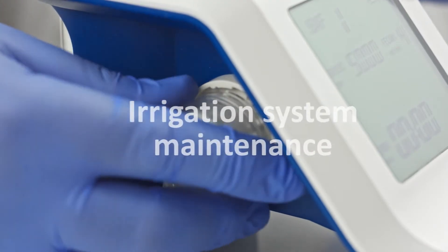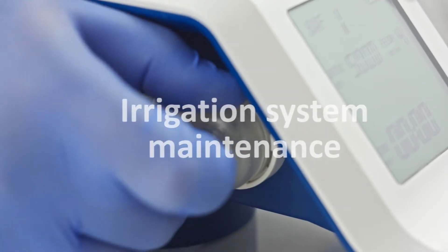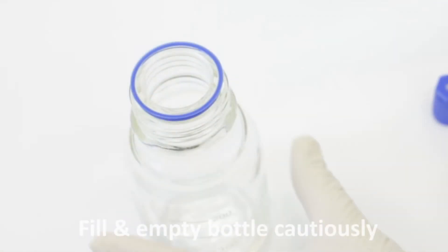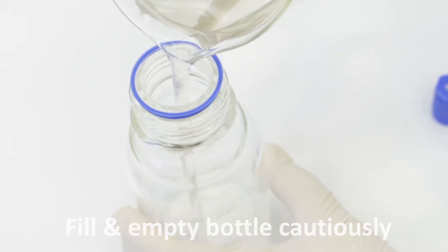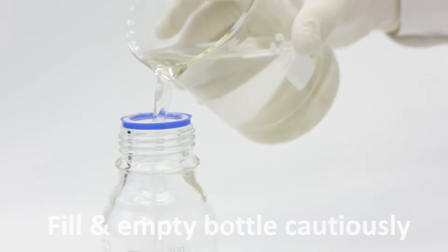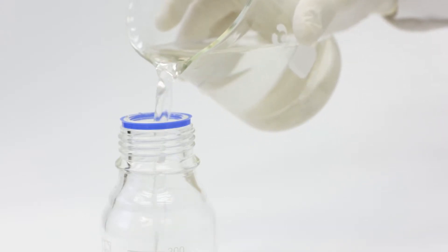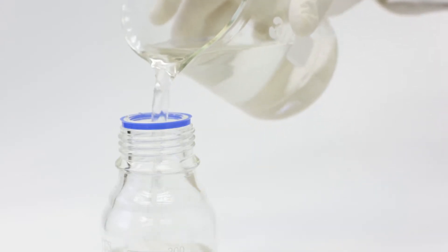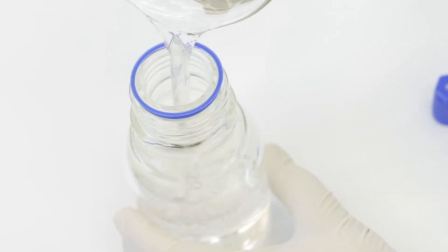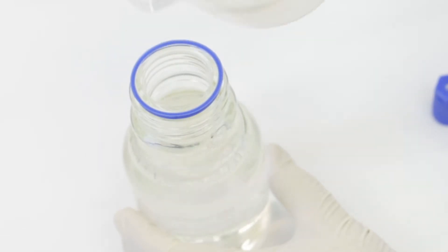The second step to avoid corrosion damage is proper maintenance of the irrigation system. Fill and empty the irrigation bottle away from the endodontic unit on a level work surface next to a sink. Avoid spillage of irrigation fluids when filling or emptying the bottle. If spillage occurs, wipe immediately. Make sure no external residue is left on the bottle before placing it in its receptacle.